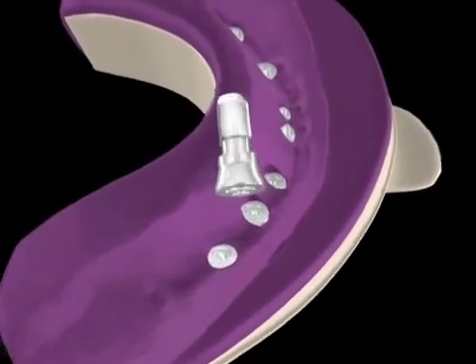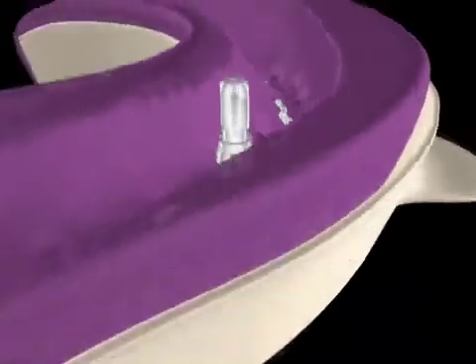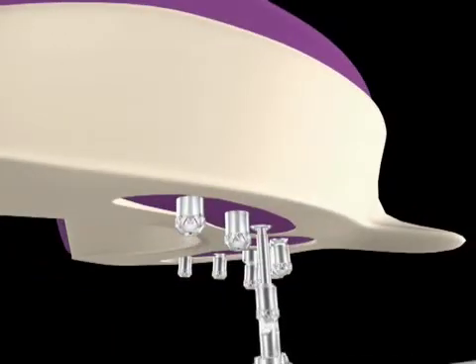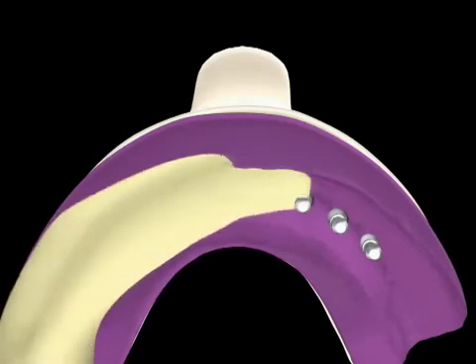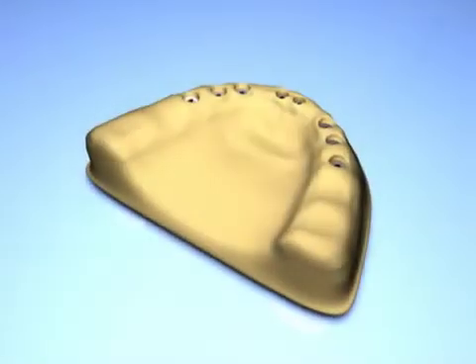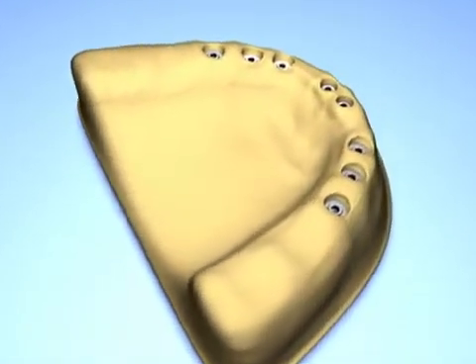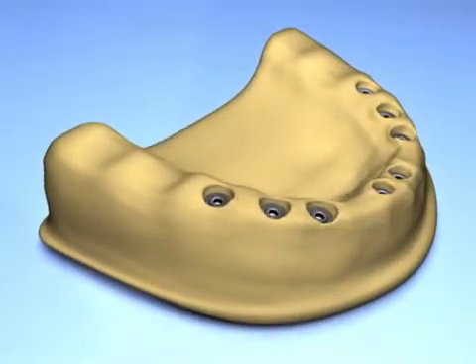The laboratory phase begins by placing the abutment analogs and securing them with long impression screws. Stone is then poured. The master model has now been generated, and Flat-1 brass cylinders are positioned onto the Flat-1 abutment analogs.